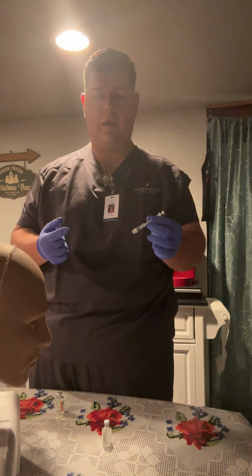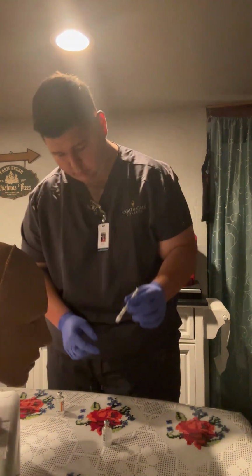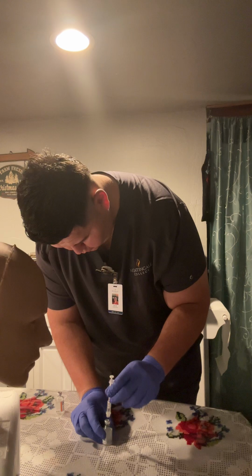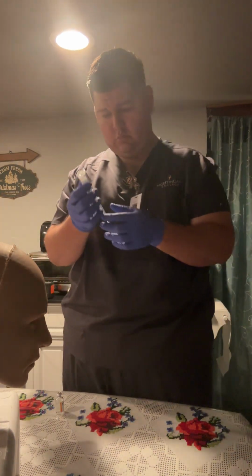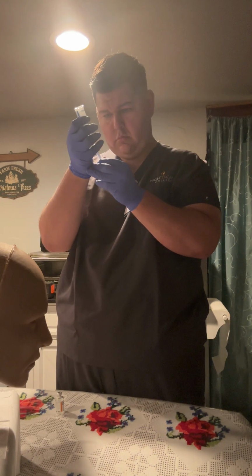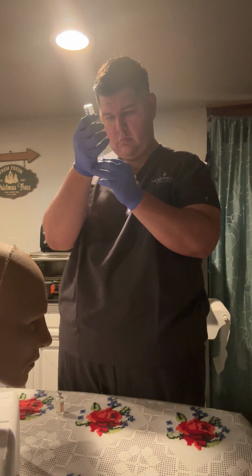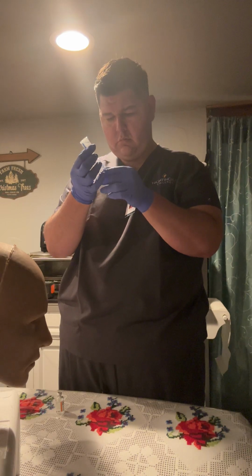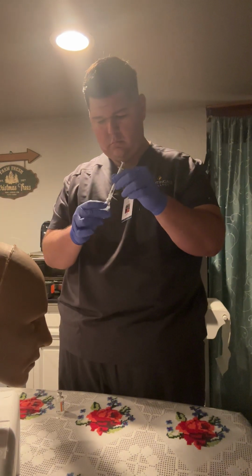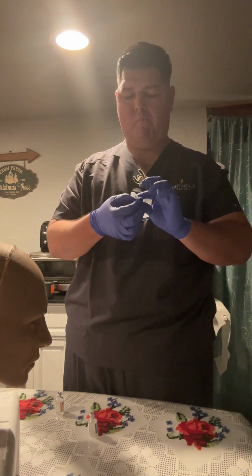So I have 4 units, and I'm going to draw 8 units of my NPH. I have my 8 units.